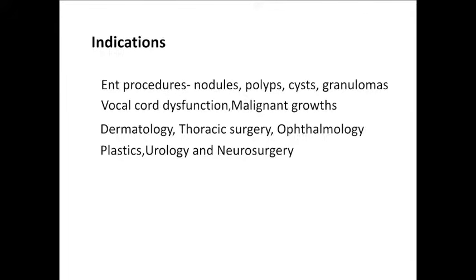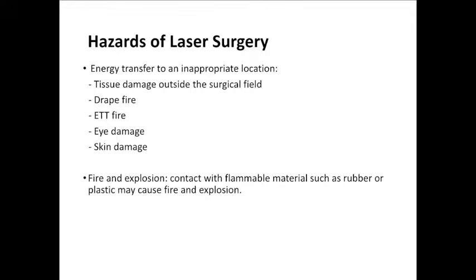Laser is light amplification by stimulated emission of radiation. The laser beam is a source of energy that can be focused with high intensity and is capable of vaporizing tissues and photocoagulating, replacing the scalpel at the microscopic level.